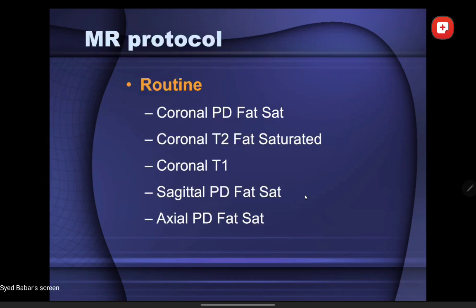So, what are the sequences? This is the important bit. What sequences should you be doing? Number one, you should be doing imaging in all 3 planes. And by the way, Aisha, if somebody wants to stop or ask questions, it's an informal session. I'm more than happy to answer questions as we go along because it becomes very difficult to remember everything. So as we go along, if somebody has a question, just raise your hand and we can always ask questions.